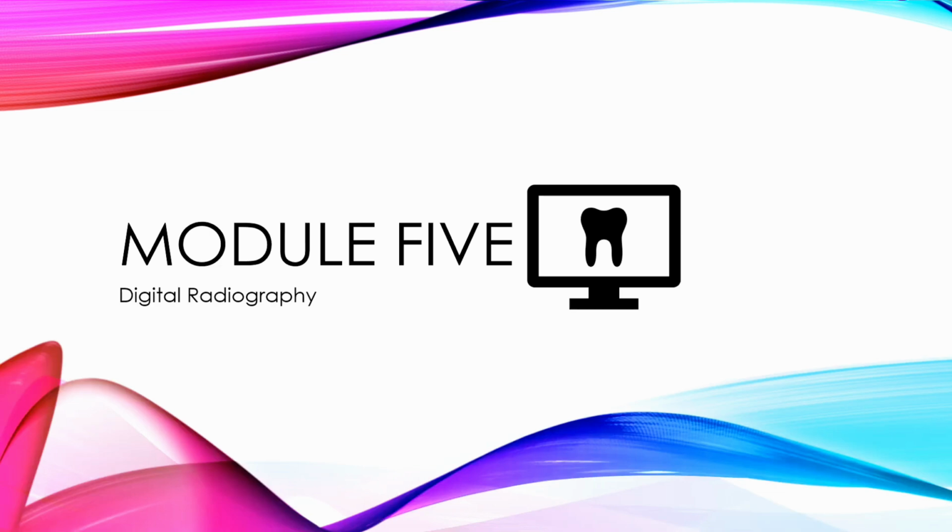Moving on to discuss digital radiography. As conventional film continues to be reduced in use significantly, digital imaging continues to improve and get better than ever. Digital radiographs were first introduced in the late 1980s. Compared to film, it offers 256 shades of gray, while film offers 16 to 25 shades. If you have ever worked with both film and digital, you are well aware of its benefits, but let's go ahead and review some of its advantages.